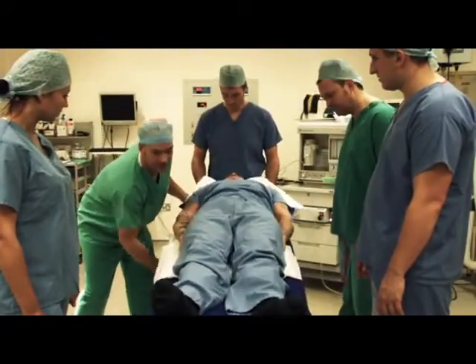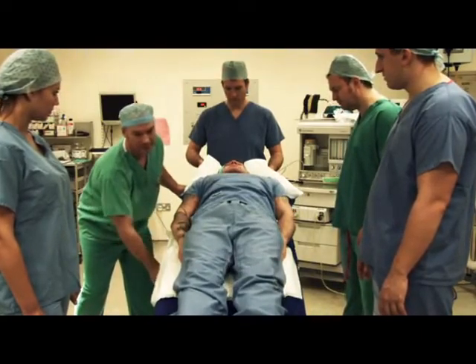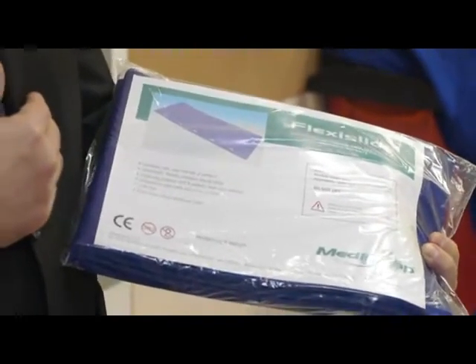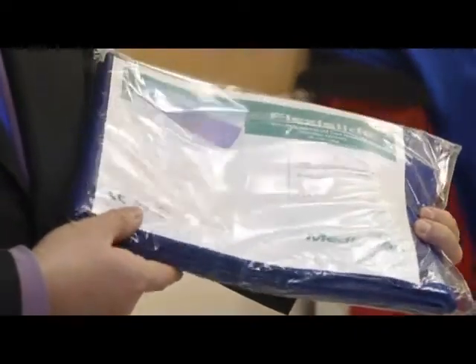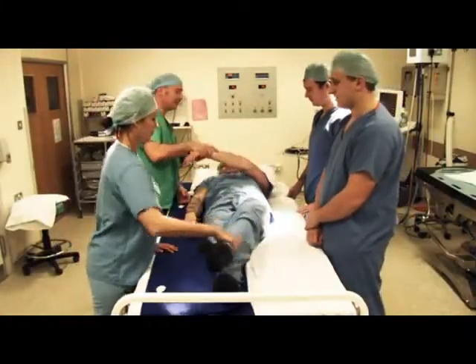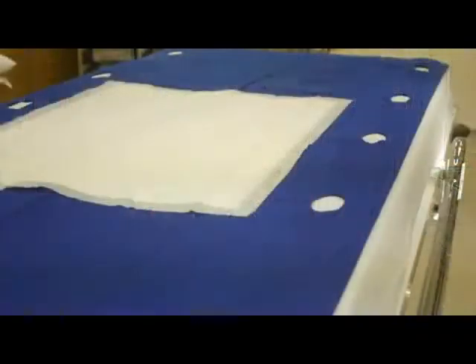The patient can be positioned in Trendelenburg as well as Reverse Trendelenburg. FlexiSlide is used for the lateral transfer and movement of patients in a procedural environment. It is incredibly strong and is produced from non-woven polypropylene in a specialised unibonded process.